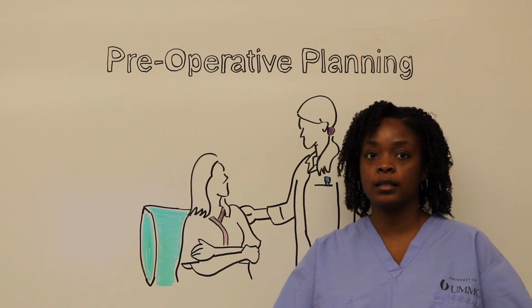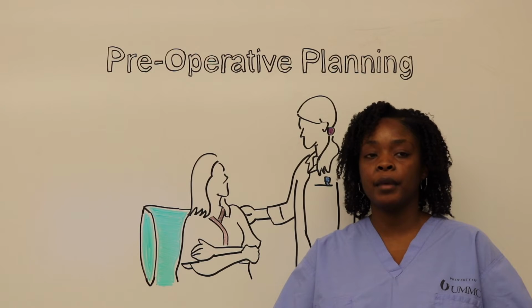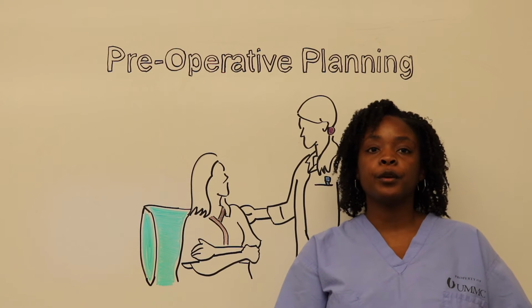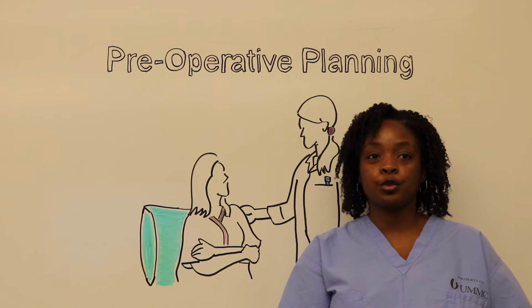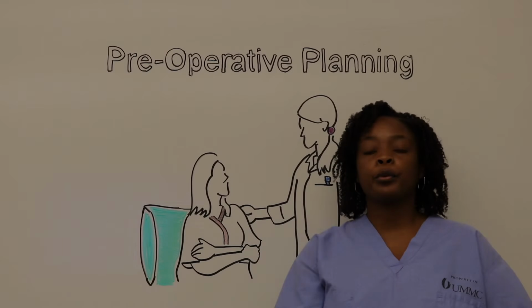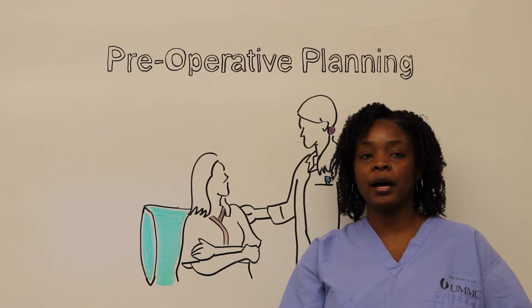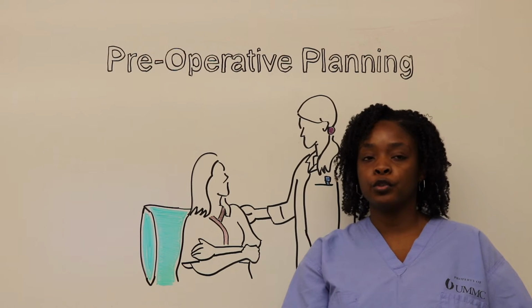Thickened endometrium during the luteal or secretory phase may mimic intrauterine polyps. For patients with irregular menstrual cycles, hysteroscopy can be scheduled at any time as their endometrial phase is less predictable. It is not recommended to undergo hysteroscopy during menses as active bleeding may decrease visibility. Pre-treatment with progestins or combined OCPs can be used to thin the endometrial lining to better improve hysteroscopic visualization.